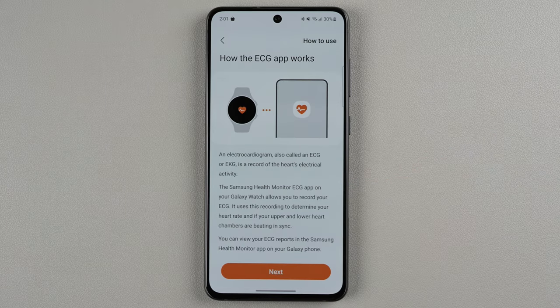It's talking now about how the ECG app works. An electrocardiogram, also called ECG or EKG, is a record of the heart's electrical activity. The Samsung Health Monitor ECG app on your Galaxy Watch allows you to record your ECG. It uses this recording to determine your heart rate and if your upper and lower heart chambers are beating in sync. You can view your ECG reports in the Samsung Health Monitor app on your Galaxy phone. Let's go ahead and tap next.